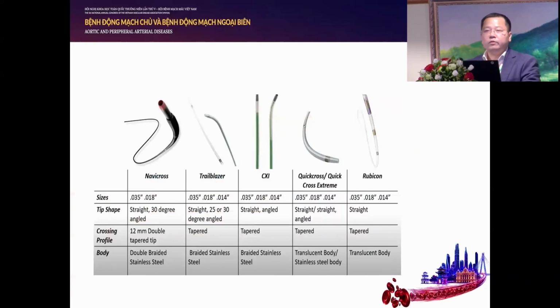Sometimes we do not have them yet. We can use only a simple balloon, but we must combine two sides. It's very easy, although we only have a balloon with a wire for 0.035.